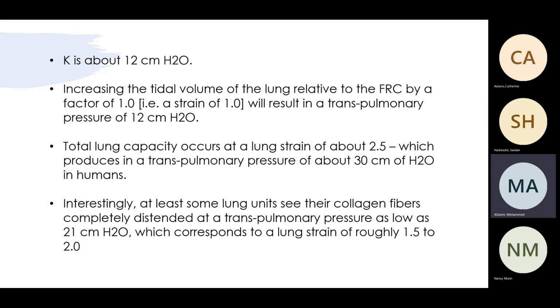That's okay. So with the esophageal balloon, what do we do? To know the pleural pressure and to be able to measure the transpulmonary pressure. And we try, this is an obese man, his peak pressure is 35, I think he can take more. Is that right? I put the esophageal balloon and I measure the pleural pressure. I find that during expiration, his pleural pressure is higher than the alveolar pressure. So I know that there's compression from outside, is that right? Then I can keep increasing the PEEP without even thinking about the peak pressure, is that right? I'll increase the PEEP during expiration to keep the alveoli open.